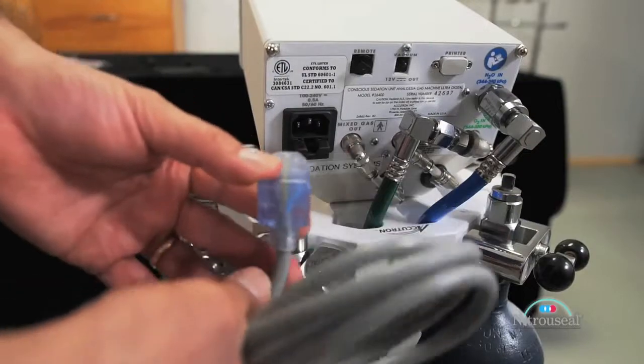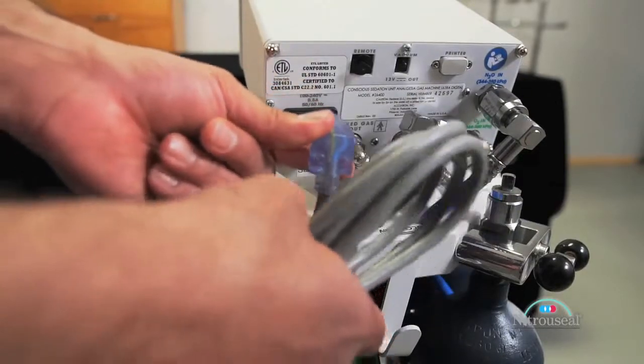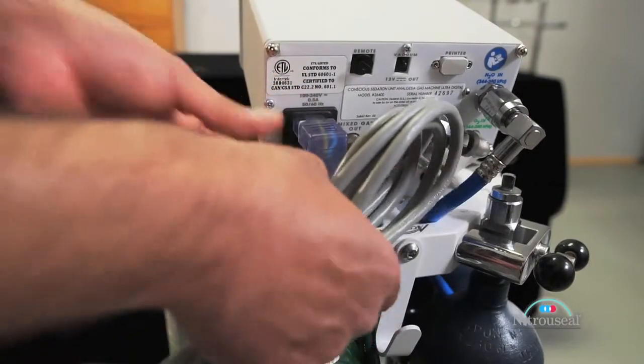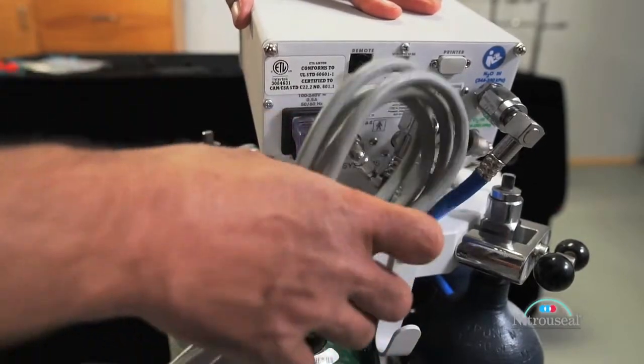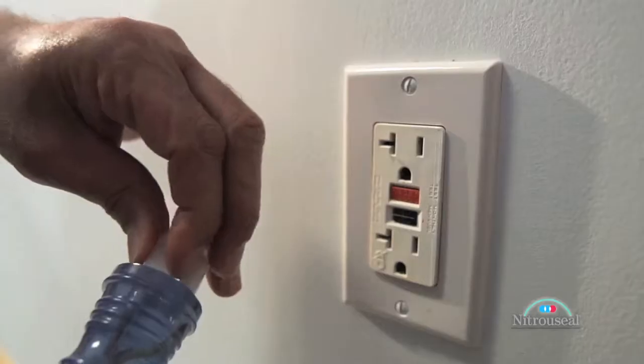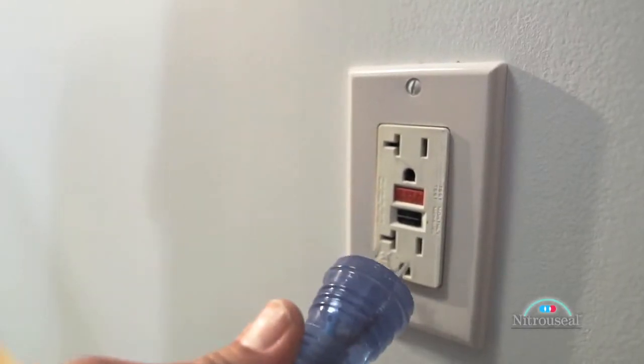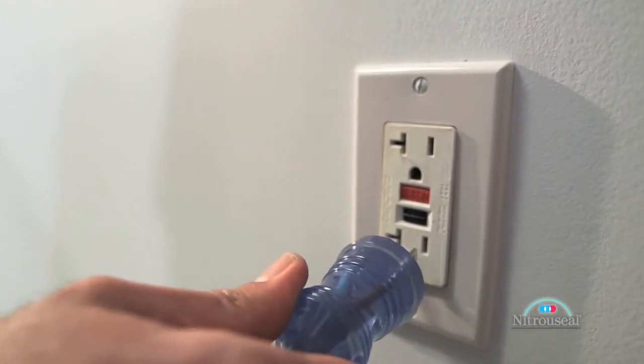Now connect the electrical power cord to its corresponding socket on the rear panel of the flow meter. Then plug the electrical power cord into a conveniently located wall outlet receptacle.